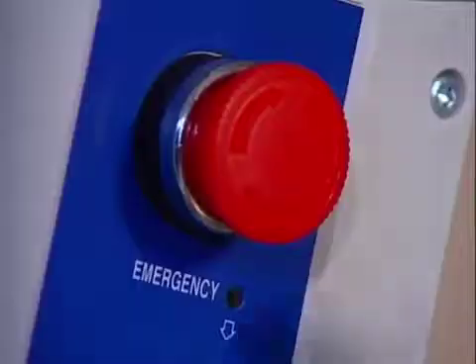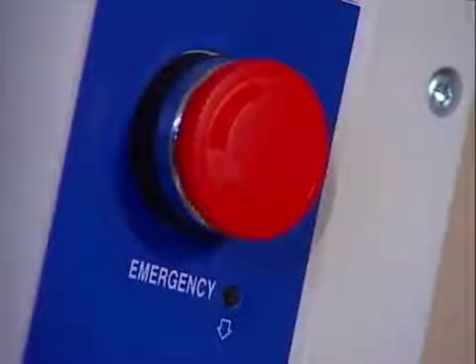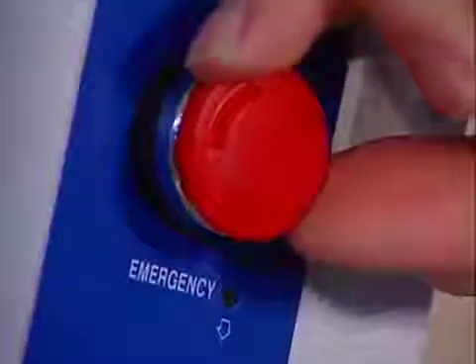If for some reason you need to shut off all power to the lift, you can deactivate it by pushing in the stop button on the control box. To restore the power, rotate the stop button to the right. It's very unlikely, but if you ever need to lower the lift and the power unit fails, you can safely lower the boom by activating the emergency release.